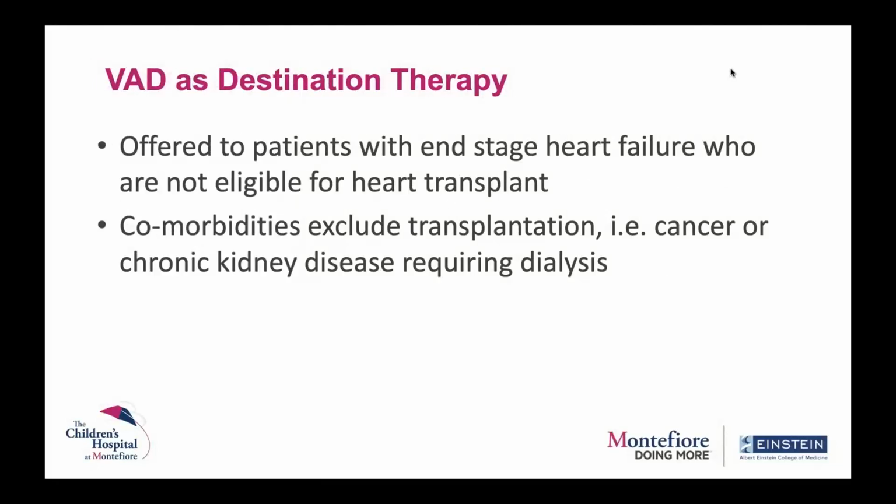What do we mean when we say VAD as destination therapy? So if we determine that a patient is not eligible for a heart transplant, but will benefit from a VAD for end-stage heart failure, those are patients that we can implant a VAD as destination therapy. Sometimes you can have comorbidities like cancer or chronic kidney disease that require dialysis, and maybe the patient's not a candidate for kidney transplant, so we cannot do kidney and heart transplant together. So if we determine that patient does not meet criteria for a heart transplant, but we want to offer this patient some sort of assistance with their heart failure, we can implant a VAD.